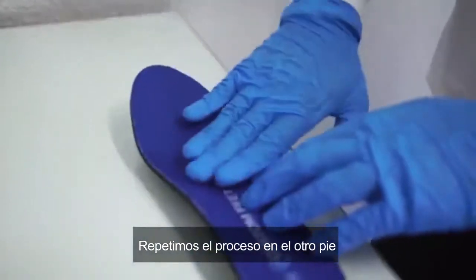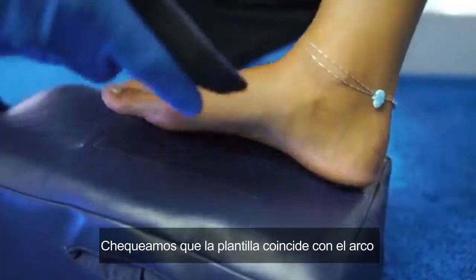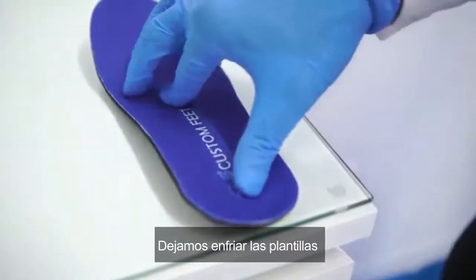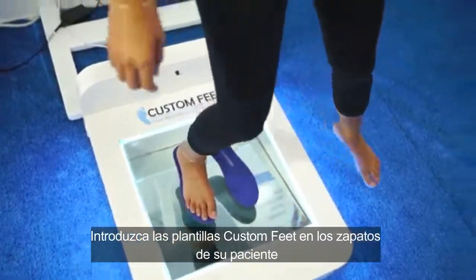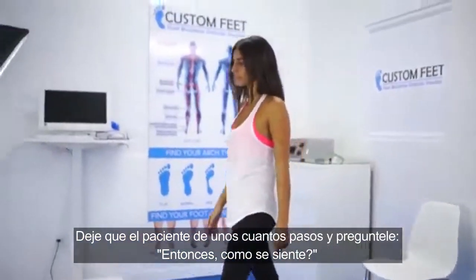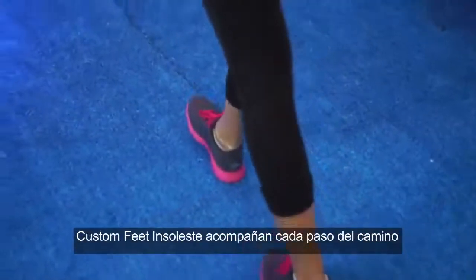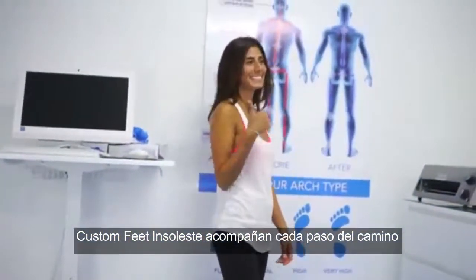Repeat steps on the second foot. Check the insole match to the arch. Check the insole alignment and shape. Let the insole cool. Place the Custom Feet insoles in the patient's shoes, let the patient walk a few steps, and ask, so how does it feel? Custom Feet insoles are with you every step of the way. Join our success.